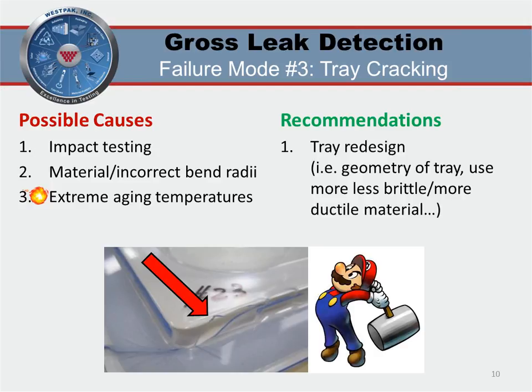Our recommendations would be to redesign the tray with the help of your vendor. They can adjust the geometry of the tray or recommend other materials that are less stiff and more ductile, which would provide additional impact resistance. Make sure you check with your vendor for design and material options. Using a more expensive material might cost you more initially, but it'll help you save money from needing to redesign.